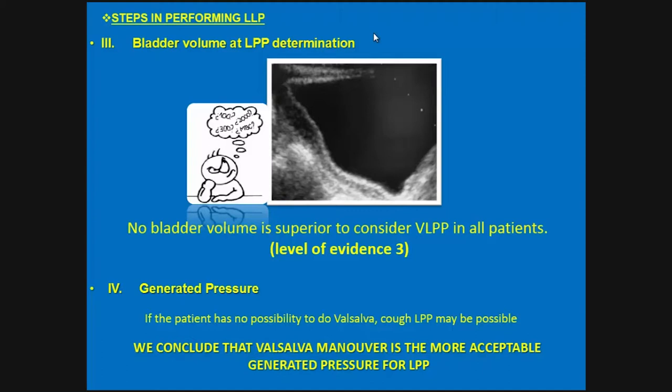Regarding all that, we do know that in the same patient the leak point pressure began to decrease as the bladder volume increases, and other studies say that there is no correlation between the bladder volume and the leak point pressure. So we have no evidence that any bladder volume is superior for considering Valsalva leak point pressure in all patients.